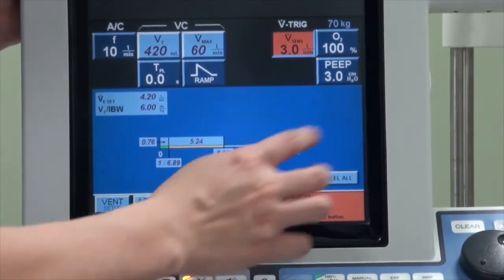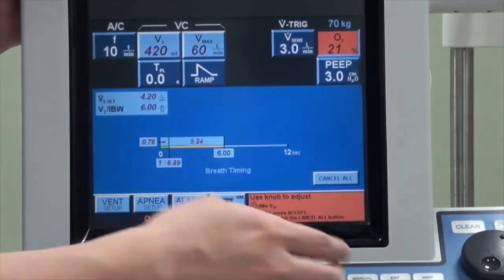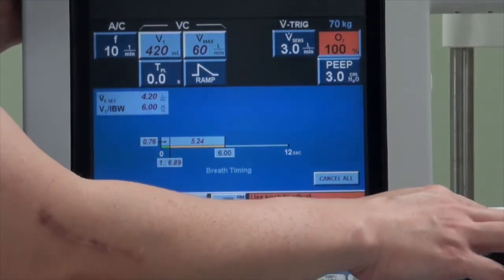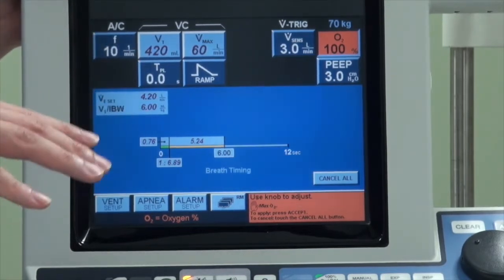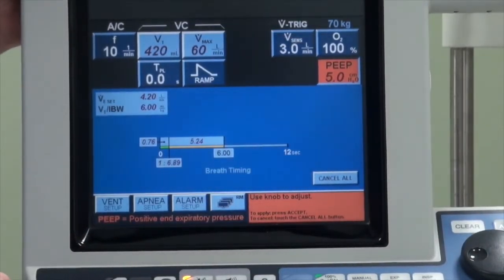O2 is the oxygen concentration delivered to the patient. It can go all the way up to 100% and as low as 21%, which is atmospheric air. Most of the time the lowest we go is about 30%. When you initiate the patient on mechanical ventilation, we will put it at 100% first, stabilize the patient, and then titrate according to the patient's saturation. The last button to set is the PEEP, which tells the ventilator to hold the pressure at the end of expiration. This helps to prevent complete de-recruitment of the lung at the end of the breath, and is very important in patients with hypoxemic respiratory failure. Typically we start with at least a PEEP of 5 and then titrate according to the patient's requirement.